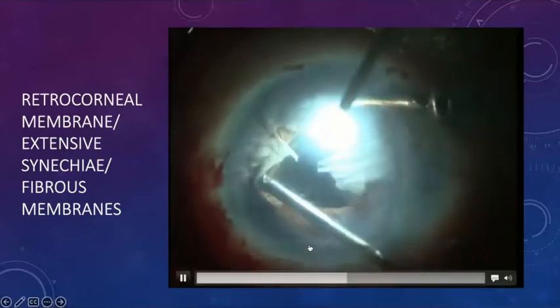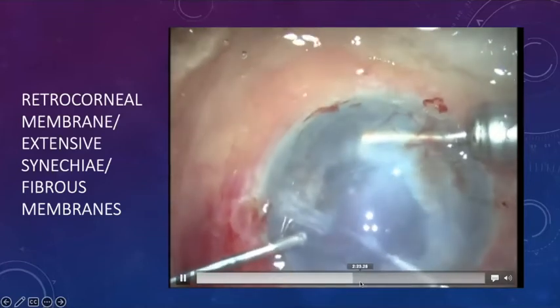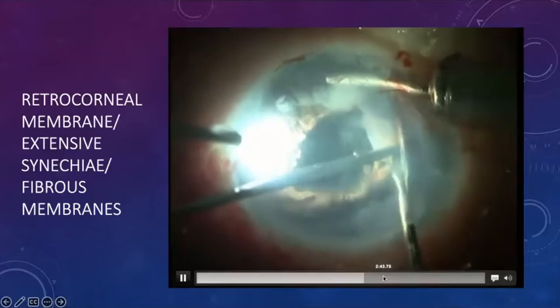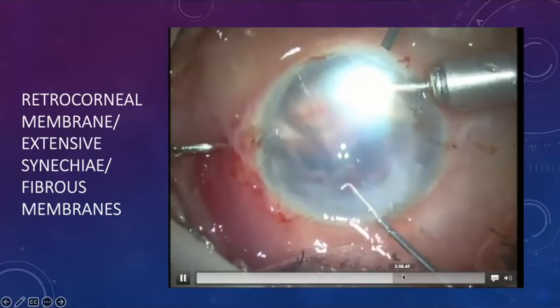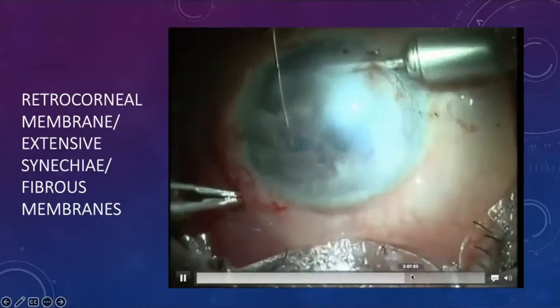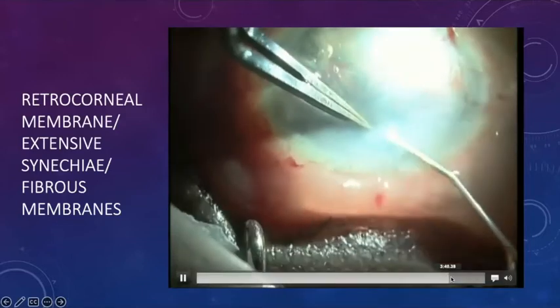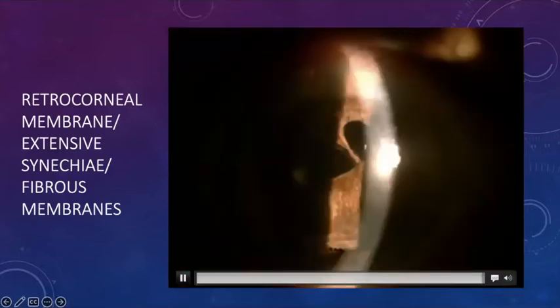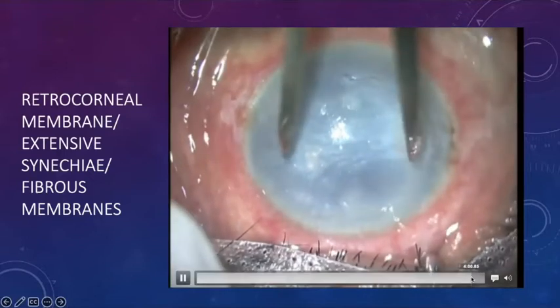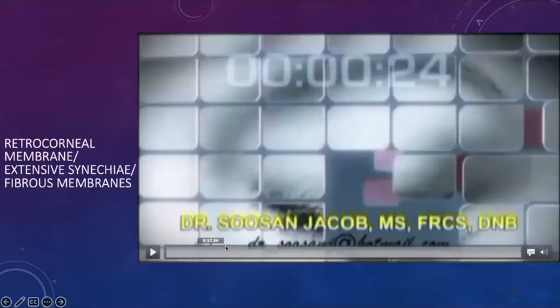So we're using a combination of vitrectomy, microforceps, peeling, a lot of the steps that vitreoretinal surgeons use. You can see membrane peeling and all that we use to remove all those membranes from the iris. And once the iris is more mobile and is amenable to a pupilloplasty, we do a pupilloplasty. We've got fluid running through the antechamber maintainer at that time, and then we go ahead and open the graft. And this is the patient's post-operative appearance. You can see it's a clear cornea, very different from what we started out with, which was like this. And we've reached a position where we are like that, which is pretty good considering everything the patient had.